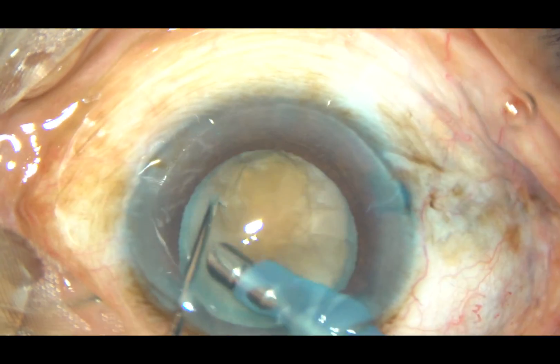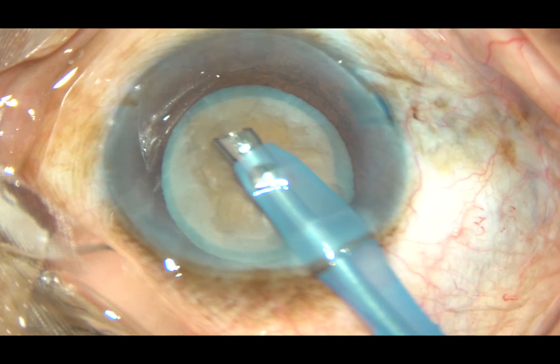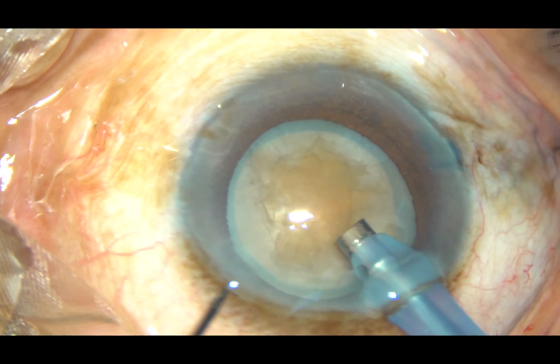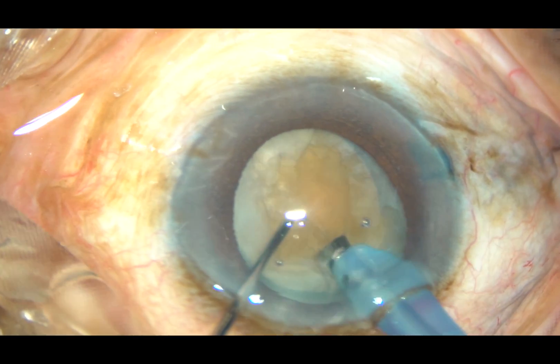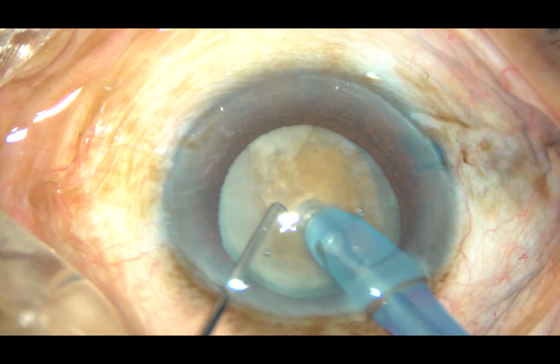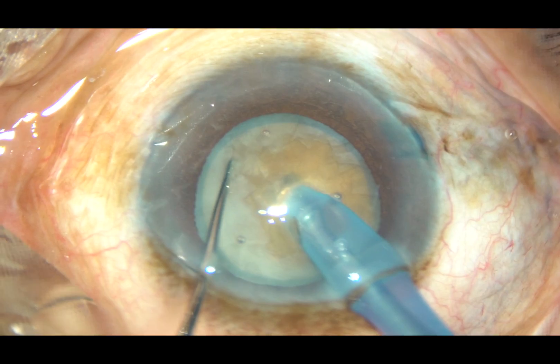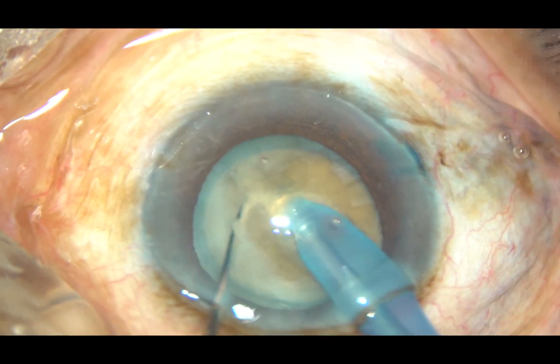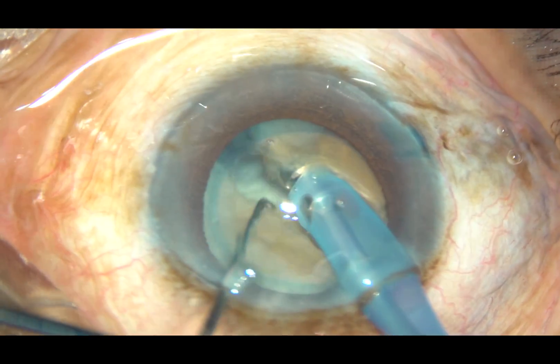You can see now the superficial, curd-like, homogeneous material. This is degenerated epinucleus, and in a very short time we will see a big chunk of it. The buried phaco tip goes a good distance and chops the nucleus. I call it the submarine chop.